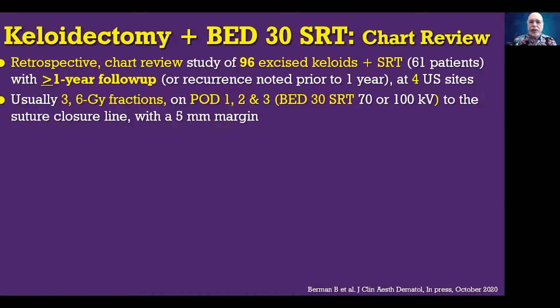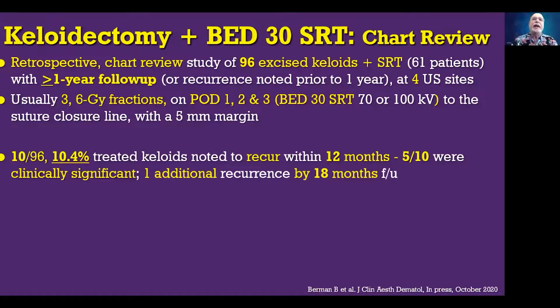So we then undertook a more formal study, which was a retrospective chart review of 96 excised keloids that had received superficial radiation therapy after the keloidectomy and had at least a 1-year follow-up. Again, on postoperative day 1, 2, 3, a biologic effective dose of 30, 6 gray fractions of superficial radiation therapy was applied. And at 12 months, the rate of recurrence of these keloids was 10.4%.